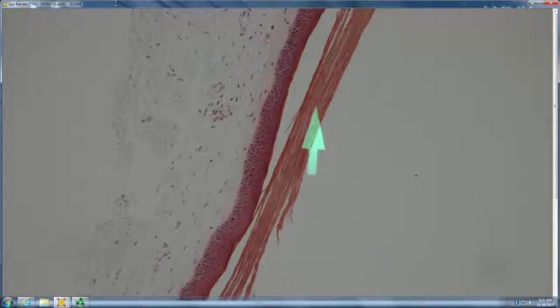Possibly ichthyosis vulgaris. Portions of it look compact and red like IV. Some are a little more lamellar. Any things you could do clinically to differentiate types of ichthyosis? So first off, is this likely to be EHK? Does not look like it. Is it likely to be lamellar ichthyosis? The horn's not big enough. No, that usually has hypergranulosis and hyperplasia of the epidermis. So this is more likely a retention hyperkeratosis.